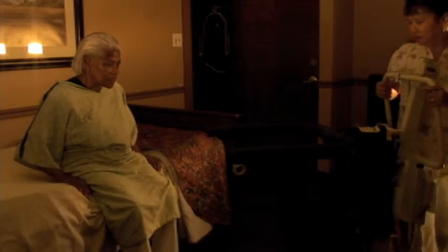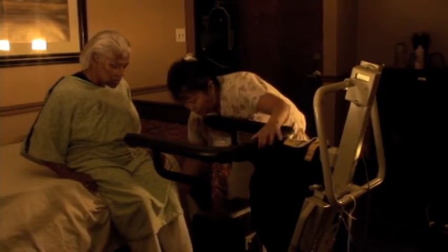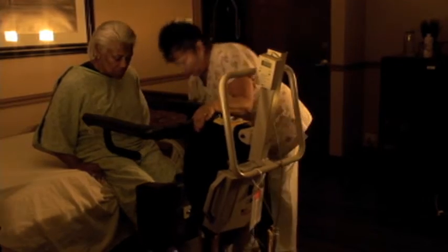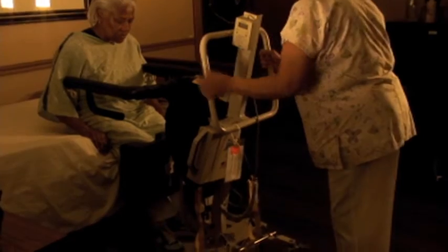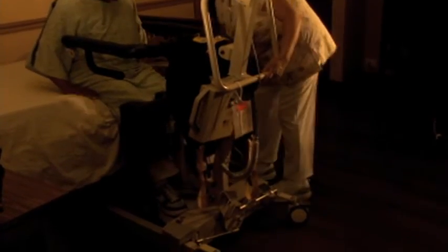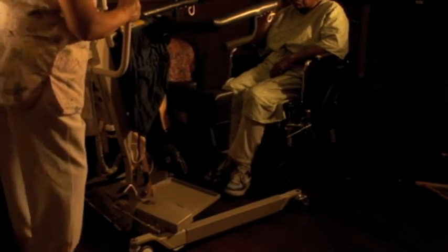To properly use a sit-to-stand mechanical lift, first, position the lift as close as possible to the desired place the resident is to be transferred. Make sure there is nothing that will be in the way while you are moving the lift from one place to another — you don't want the resident in the air too long. The legs on the lift flare out, so if you need to get a resident out of a chair, you can widen the legs to get them around the chair legs. Just make sure you put the legs of the lift back to their normal setting as soon as the lift is clear of the chair.